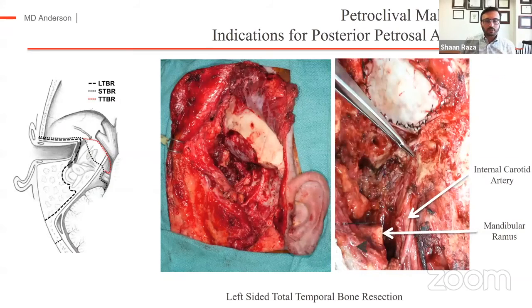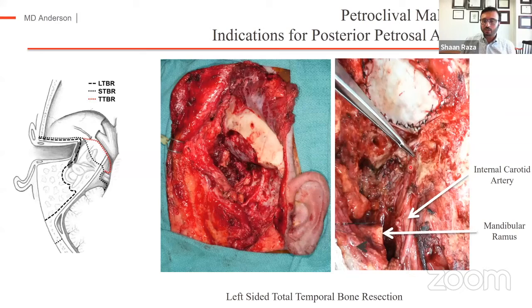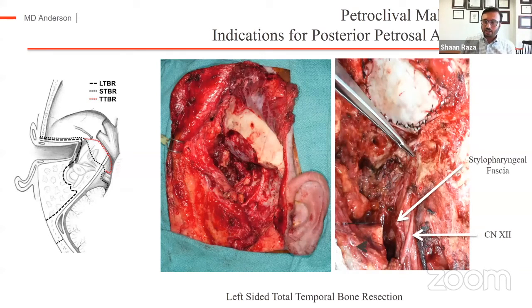Here are the views intraoperatively from that total temporal bone resection. You can see the facial nerve skeletonized going into the parotid gland. At this point, the infratemporal fossa, the middle fossa, and the temporal bone have been resected. Images on the right show the parapharyngeal vertical petrous carotid. The forceps are on the junction of the vertical petrous and horizontal petrous carotid artery. The suture line is on the eustachian tube, which was closed up at the end. The other suture line is on the stylopharyngeal fascia — a good fascial barrier to preserve throughout the dissection to protect the lower cranial nerves exiting the jugular foramen.